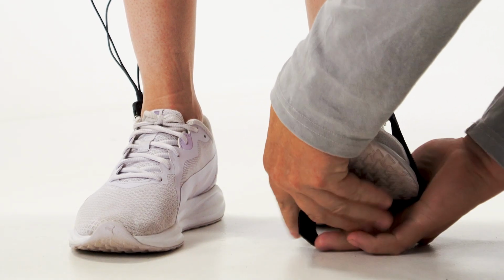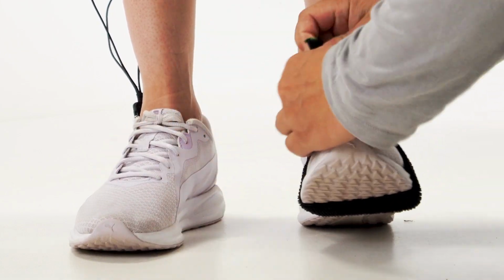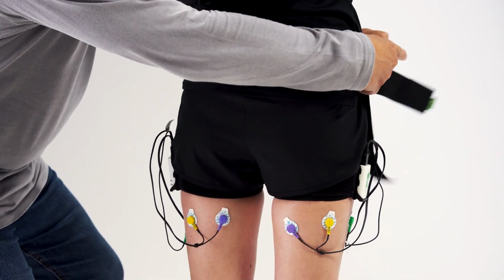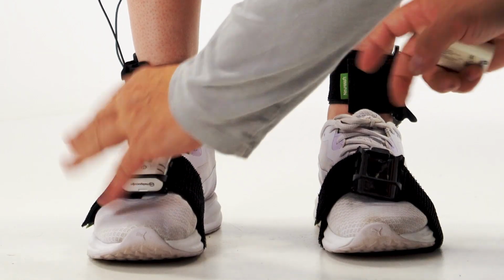After that, using elastic bands, we attach sensor holders to the calves, the hips, and sacral area. We place the sensors in the holders and connect the EMG electrodes to them.